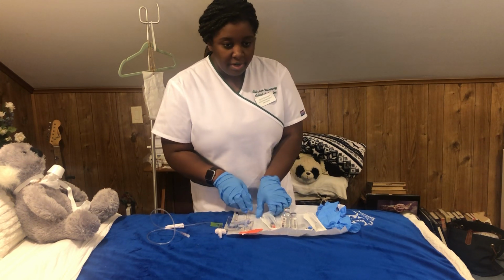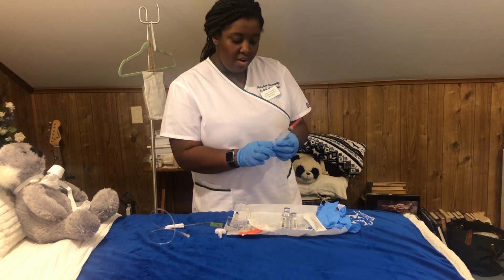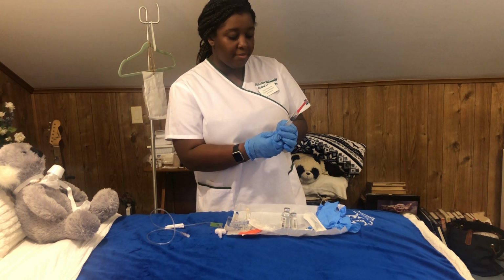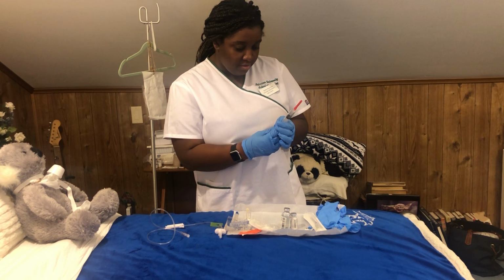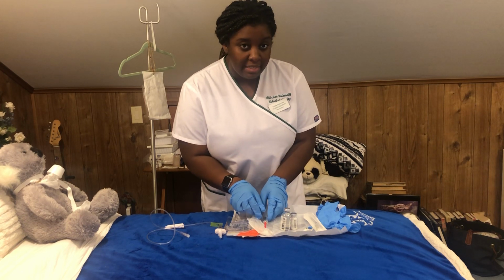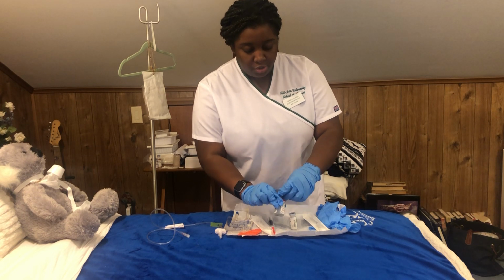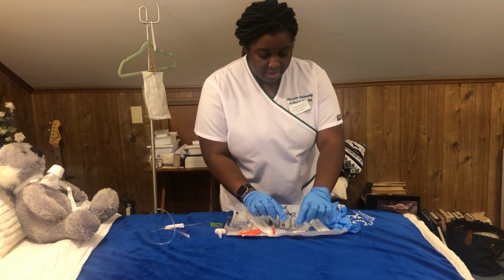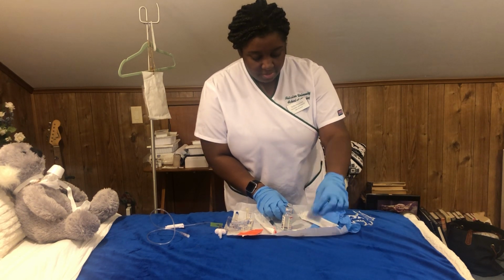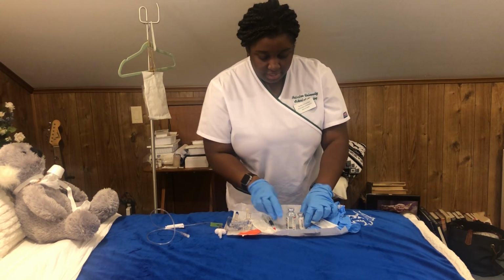So just going forward, I have my syringe here. This is a 12 ml syringe, and I will pull in air to 5.6 ml of air. Before I uncap, I just want to perform aseptic techniques. So I will use an alcohol swab to wipe off the top of my normal saline bottle, and another swab to wipe off the top of my vancomycin vial.